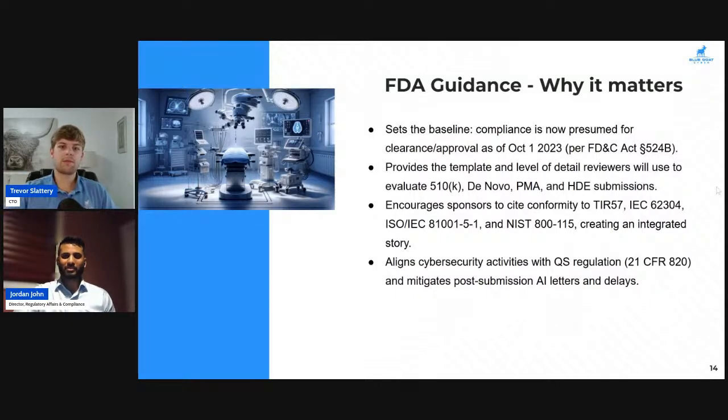Yeah, I think that's a great question, Trevor. Just looking at the finalized guidance document, at a high level, it looks more or less the same. We've been dealing with these submissions almost daily, submitting quite a few to the FDA. We get feedback all the time and improve our processes internally. But for someone who has no system in place, it's important to focus on this new guidance. If you don't have that legacy information on FDA feedback about what to improve, it does seem like a shift, although it is not quite.